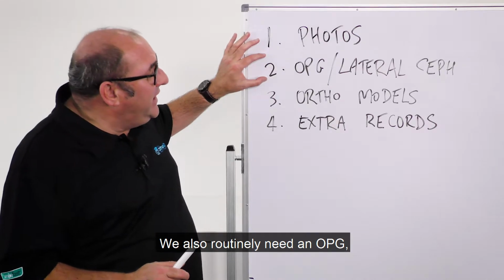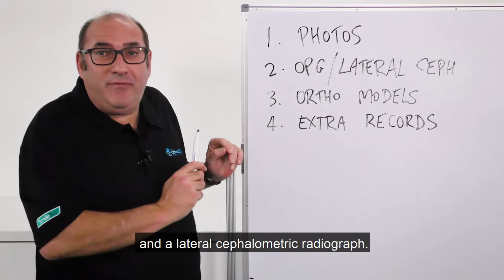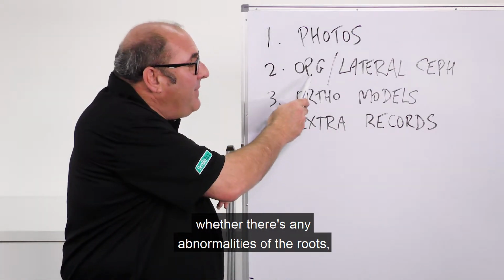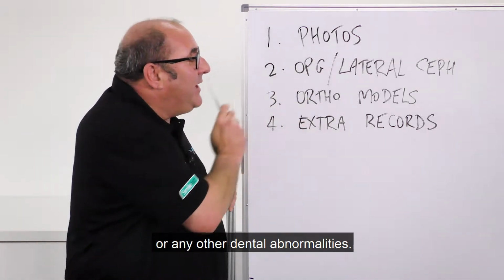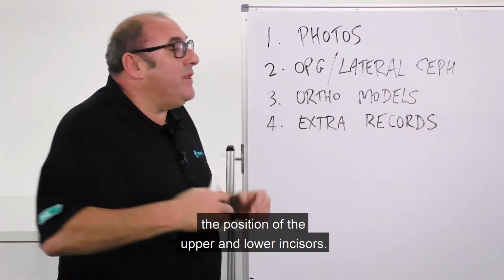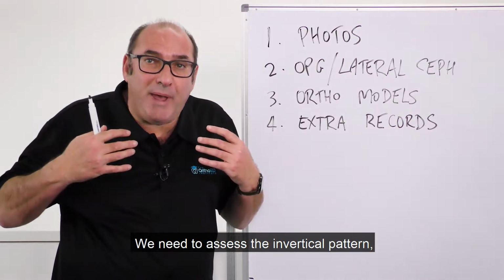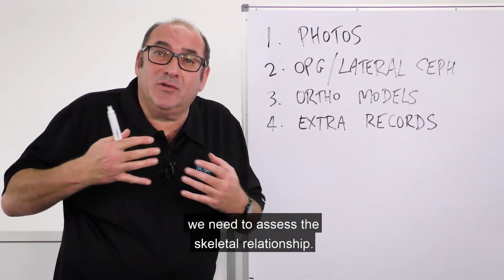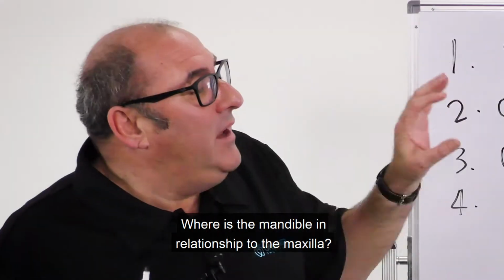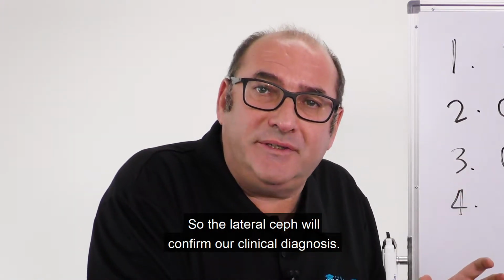We also routinely need an OPG and a lateral cephalometric radiograph, so we can assess whether there's any missing teeth, whether there's any abnormalities of the roots, or any other dental abnormalities. And with the lateral ceph, we need to assess the position of the upper and lower incisors. We need to assess their vertical pattern. We need to assess their skeletal relationship. Where is the mandible in relationship to the maxilla? So the lateral ceph will confirm our clinical diagnosis.